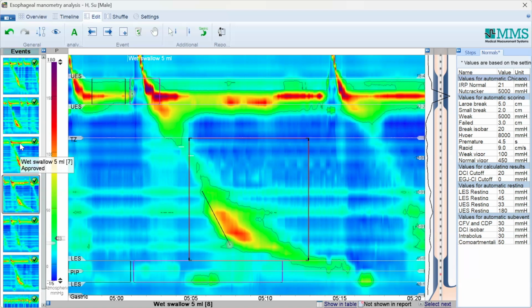And maybe if the catheter migrates, we need to reseat it if needed. And yes, if a swallow is contaminated, if it's wrong, we delete it and repeat it. We do not let that artifact define the results of the study because they may have some severe clinical consequences for the patient, right?